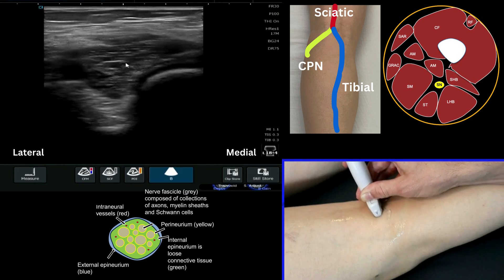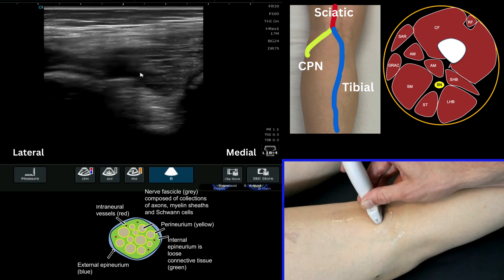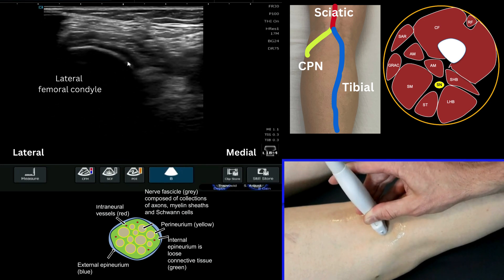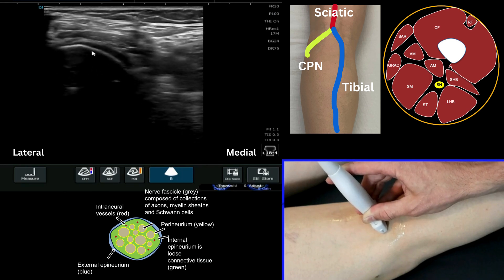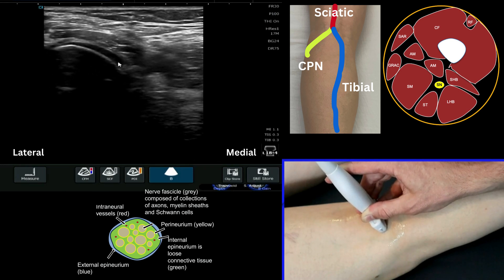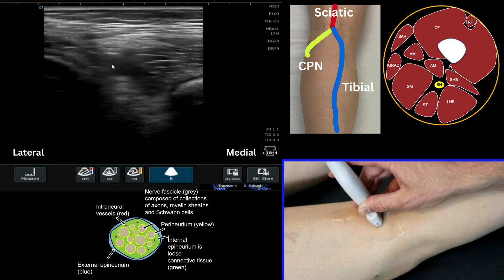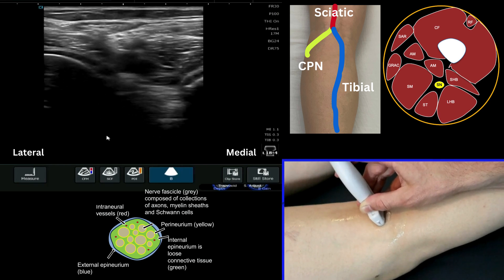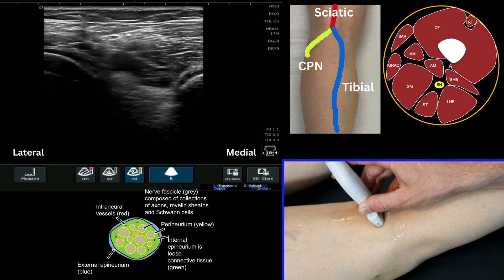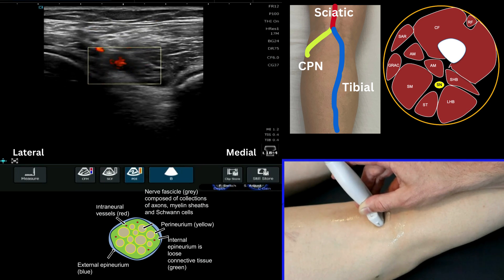If I move my probe medially I've got the medial femoral condyle, and if I come laterally I've got the lateral femoral condyle. We can be very clear about that because we've got this hypoechoic region on top, which is articular cartilage. Coming back into the centre we can see that popliteal artery, and we can also highlight it with Doppler to identify it as a pulsatile structure.